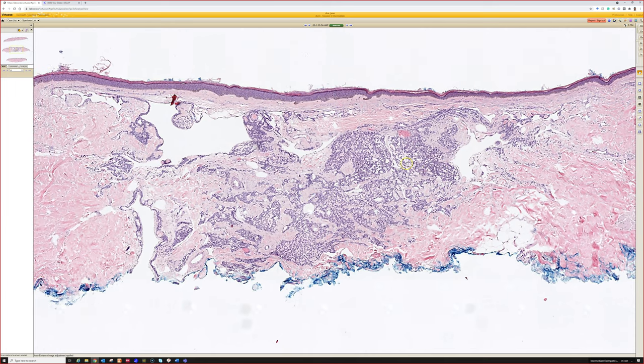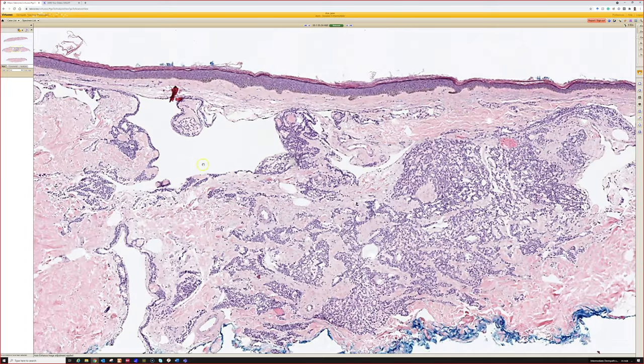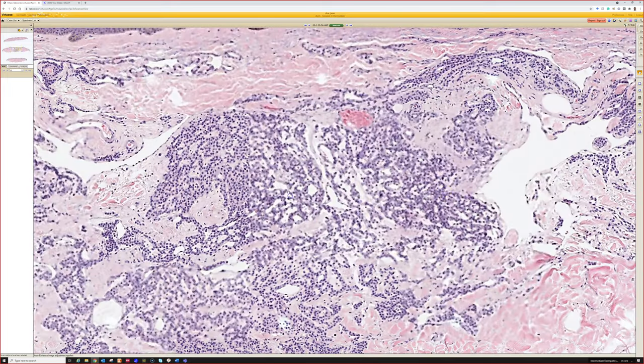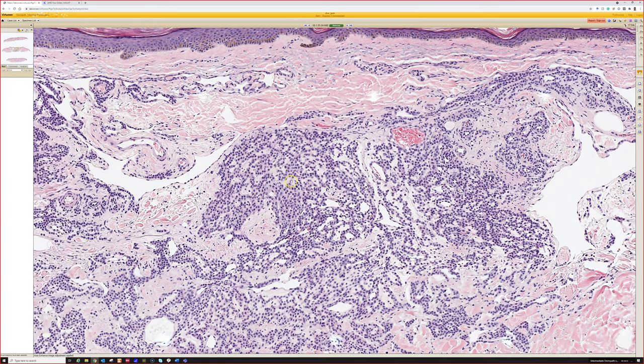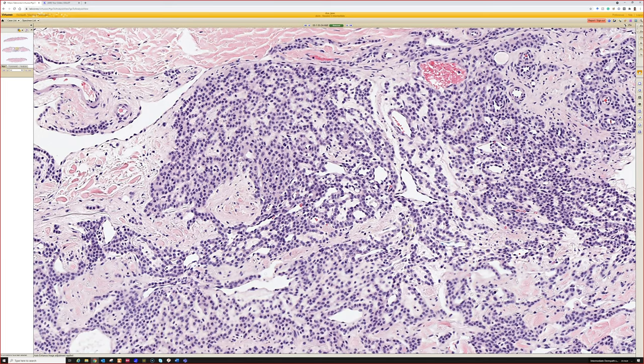Very good. Glomangioma and glomus tumor are closely related and overlapping, but when there are lots of big dilated spaces, I tend to call it glomangioma. They're composed of very uniform round blue nuclei, usually with some pink cytoplasm. Because of that, they can sometimes mimic sweat gland tumors. I've seen cases that were more solid and looked a lot like hidradenoma, and closely mimic that because they can sometimes have pale or even clear cell cytoplasmic change.